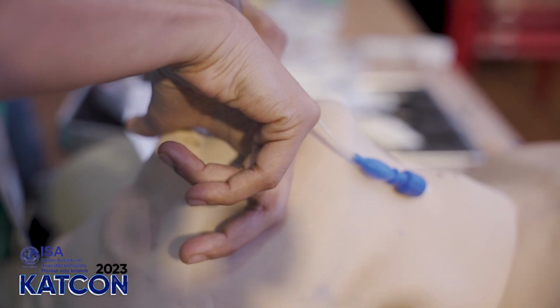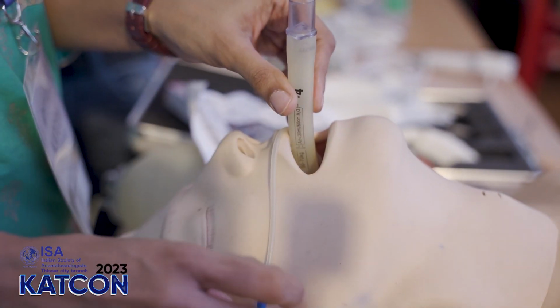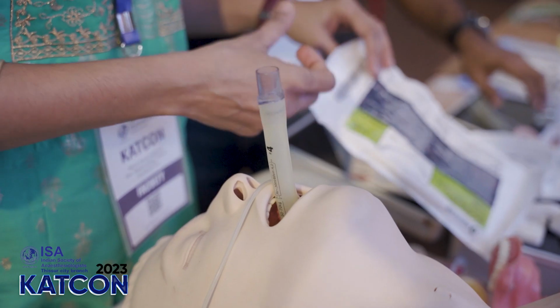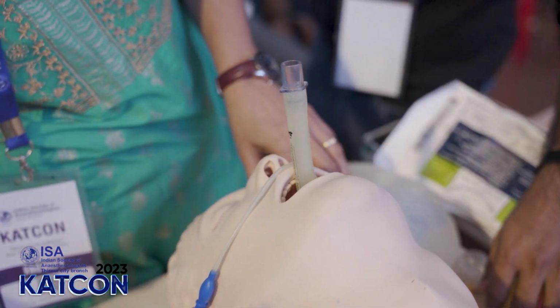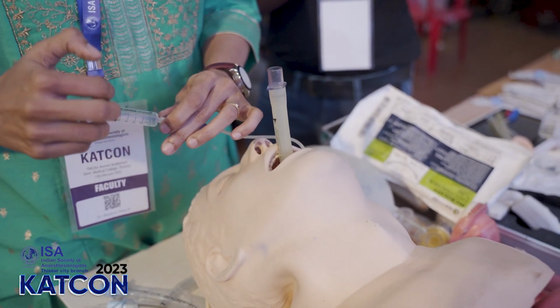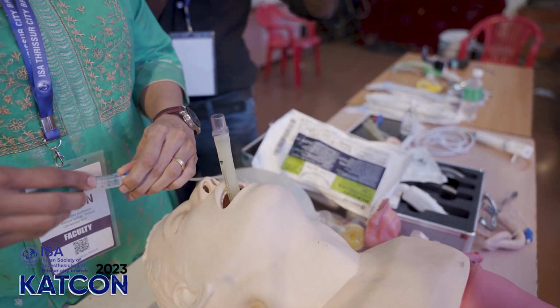The cuff is deflated. Either you can keep the cuff inflated or deflated. Here she has not inflated the cuff and she has inserted. Next step is you inflate it using a syringe. So this is a size 4 tube, so maximum you can put 30 ml. So she is introducing 30 ml.